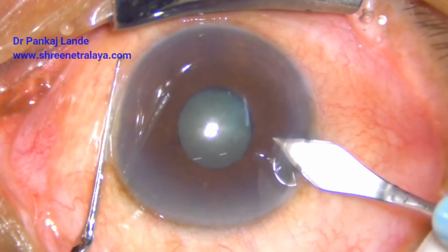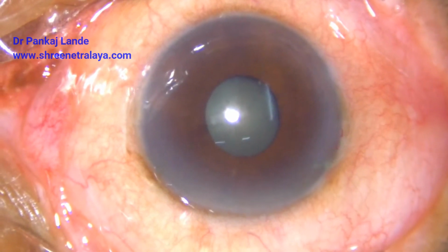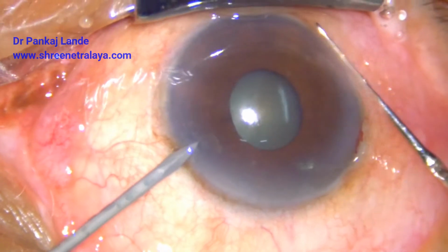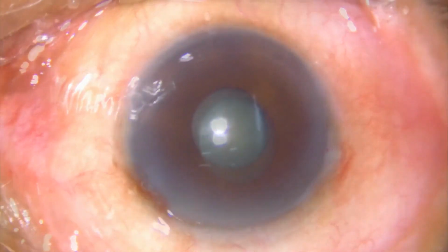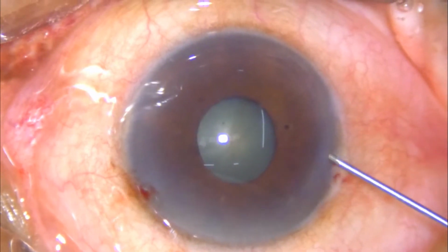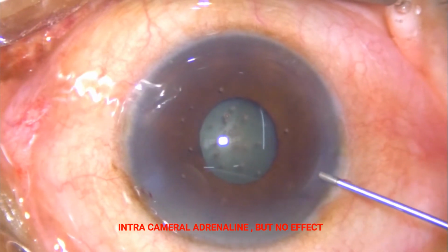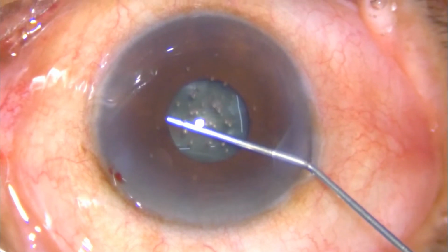Good pre-operative evaluation is very important while operating such cases. I strongly recommend pupil expander devices to be used if you are not comfortable with the given size of a pupil. Additionally, if there is a patient who is on multiple medications and can have an issue of floppy iris, then it is better to have intraoperative pupil expander devices.